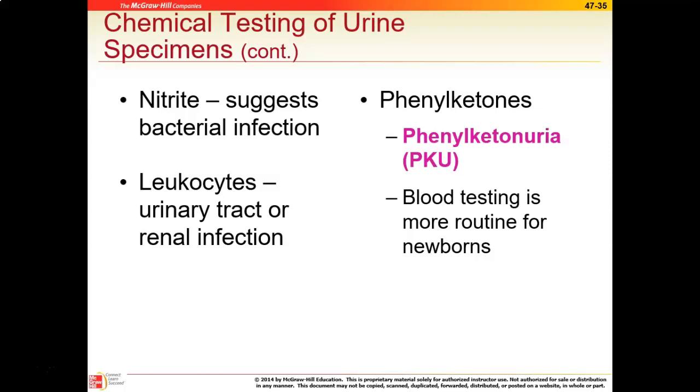So there is a urine test that checks for it. However, we won't be doing that. It's not part of our normal routine urinalysis, and it is not one of the pads on that 10-pad dipstick. Okay.